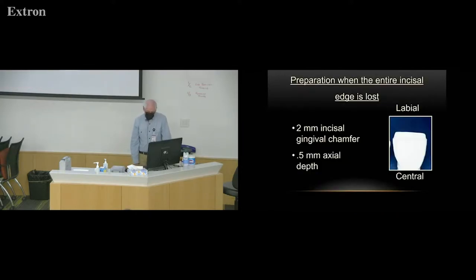Okay, so these are some big plaster models that I had many years ago at UOP that I used to use for teaching, but I thought they'd be helpful. So let's talk about this preparation.